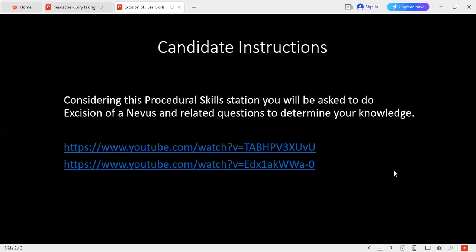First of all, I will take measurements. I will make an ellipse with a ratio of 3:1 on the lateral sides, and on the superior and inferior sides 2 mm of distance is required. Then I will join all the measuring points, making an ellipse.